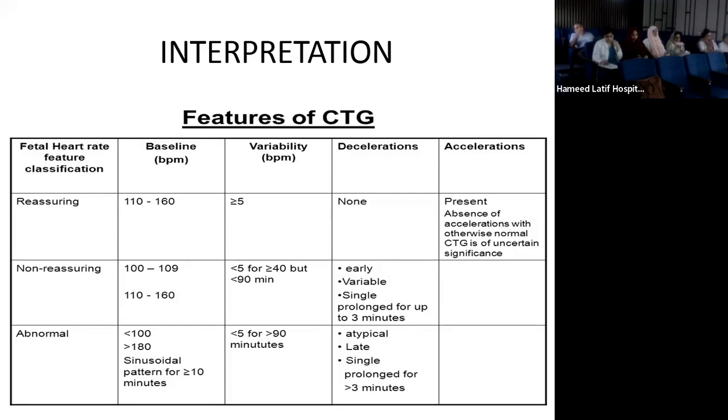Thank you. Understand. The pattern of sinusoidal is, you said more than 10 minutes. I think it's close to 30. Chalo, that's variable, I'll teach the old one. But the thing about sinusoidal pattern is you need to see it. If anyone has access, look up sinusoidal on Google, because it looks very straightforward, but it's very important also. The other problem with sinusoidal is, as I mentioned, the baby can be sucking its thumb and creating a sinusoidal pattern.